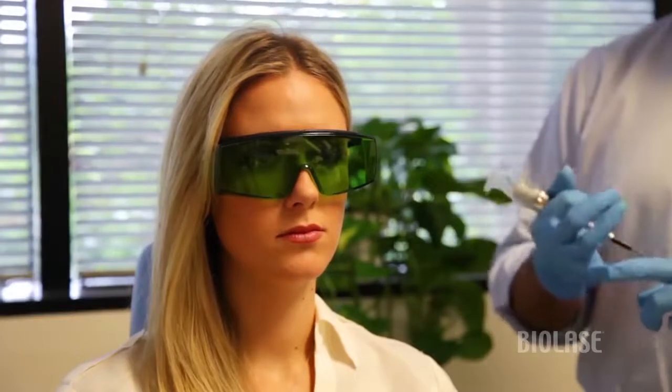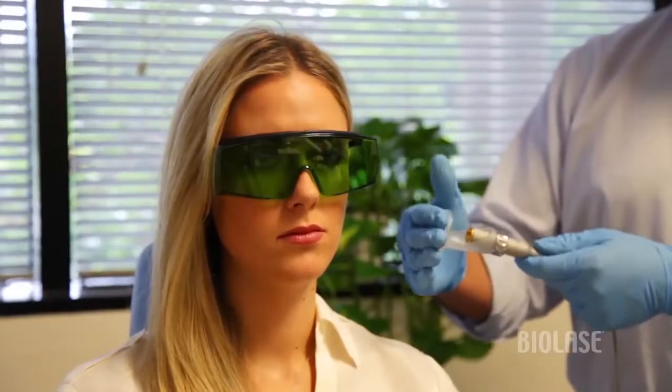Typically with light therapy, the targets are going to be either the site of injury — in this case there's no injury — we'll treat lymphatic nodes, we'll treat trigger points, and we'll also treat musculature that's been affected.